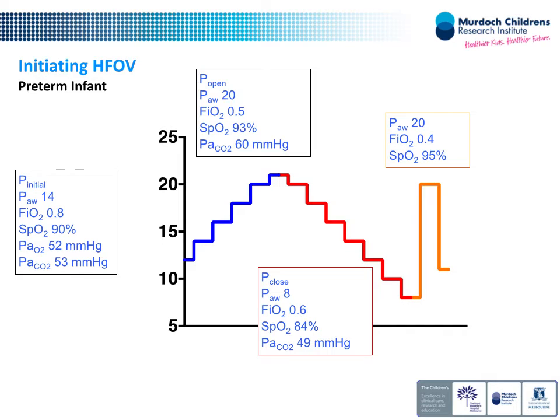because all we've done now is map this baby's lung at this point in time. And all we've got is a measure of how the general lung is behaving. The disease will change, the baby will change, and the pressure-volume relationship will change. And the cliff may change.